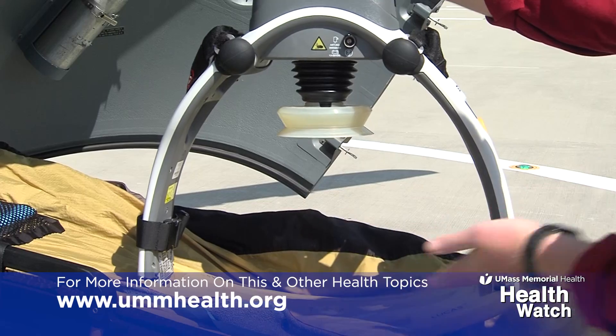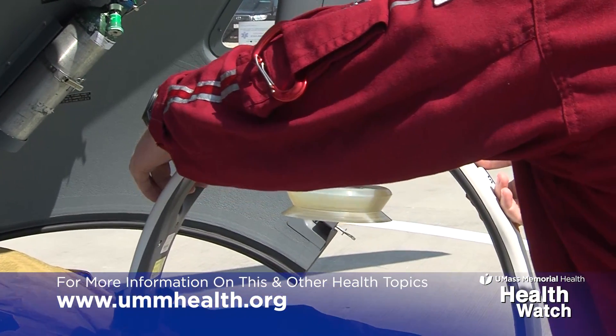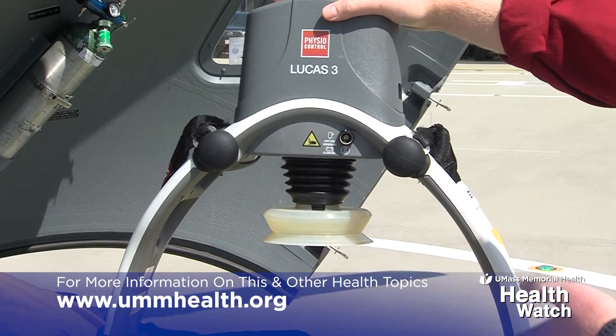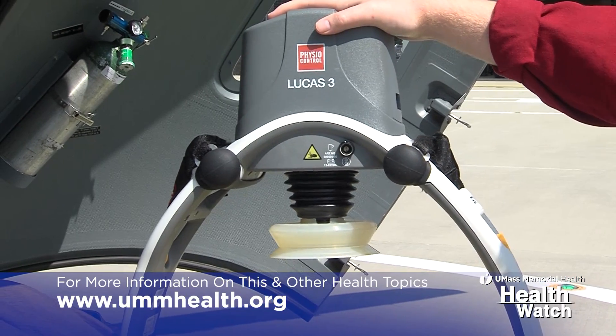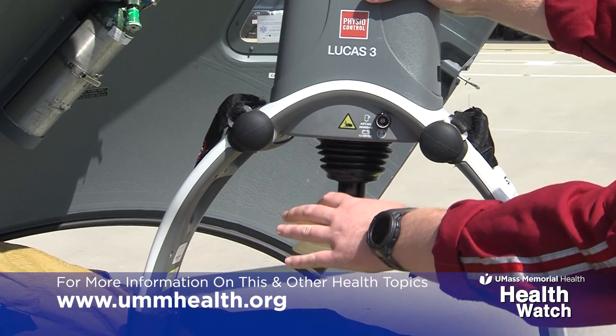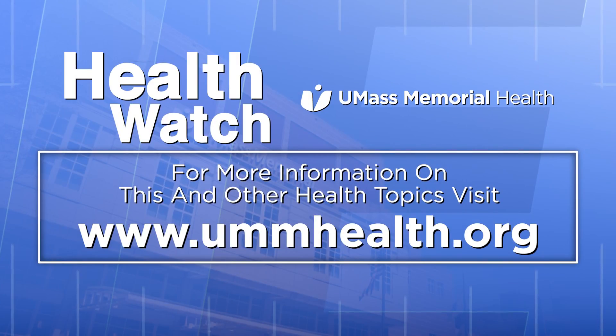Once the base plate is in place, this upper part — utilizing these two buttons — we're able to click the device into place over the top of the patient's chest. Where you would normally do chest compressions, kind of between the nipples, this device will come down the plunger, and then we just press the play button and it will automatically perform chest compressions on a patient.